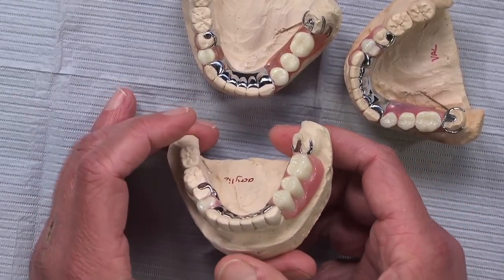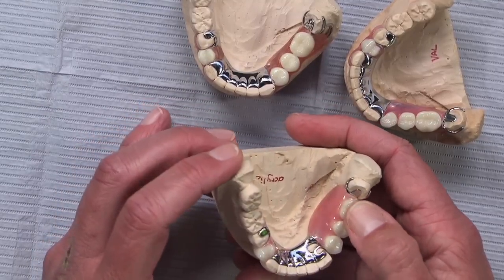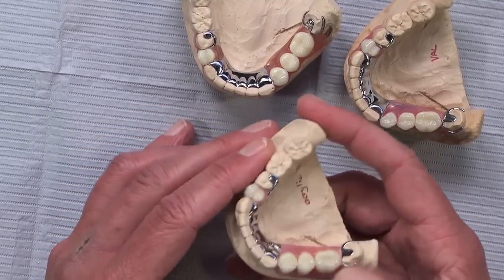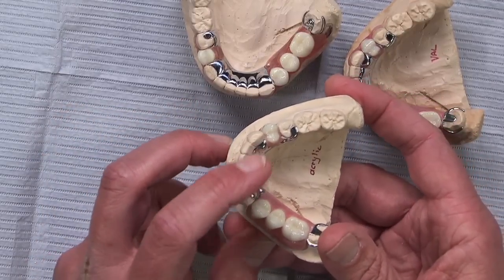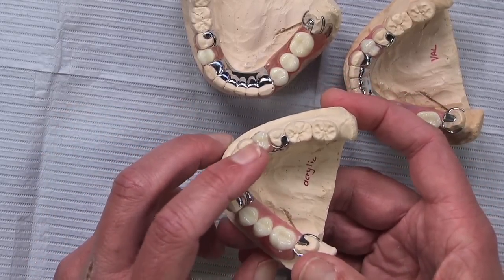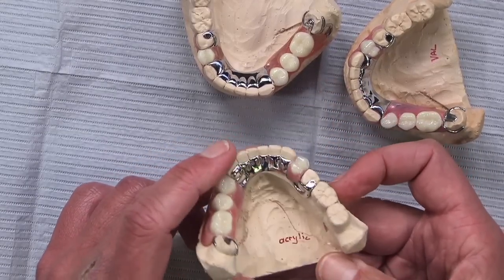So we want to make sure that it's not a free-end case because it's not going to work very well there. So it is aesthetic clasping, and we get a nice intimate fit here with metal that we probably couldn't get with any other material there on that apron. I mean, it really gives a nice fit as it works against the lingual of those teeth.